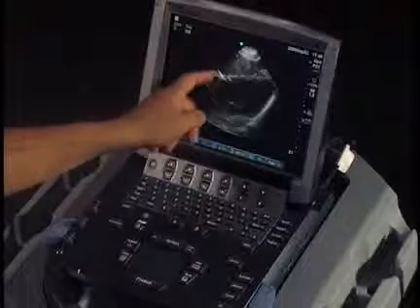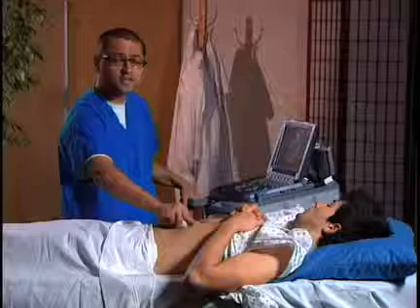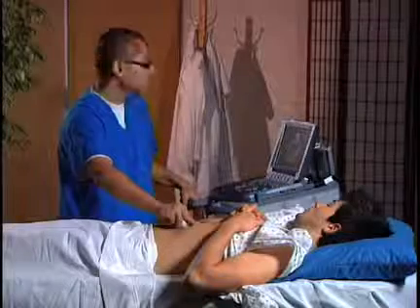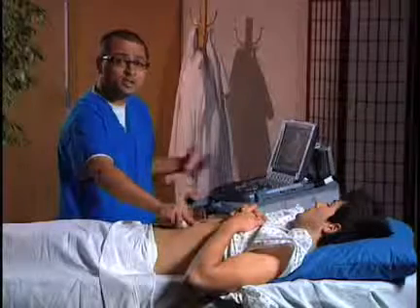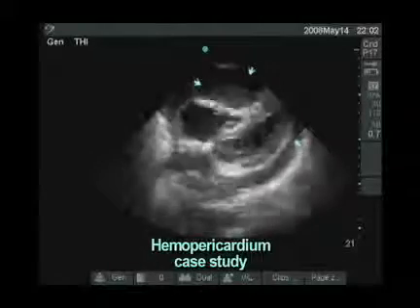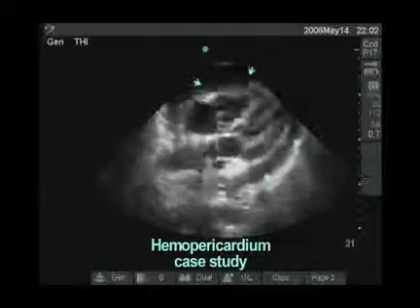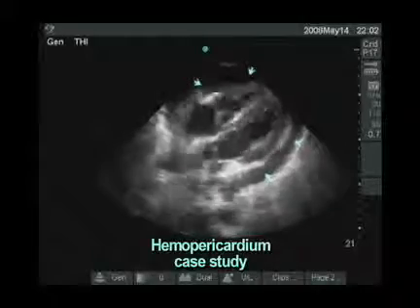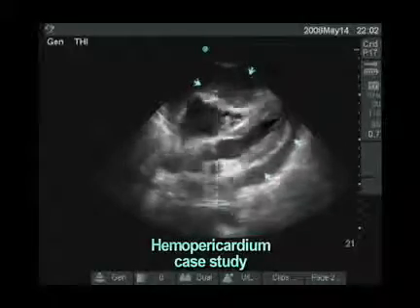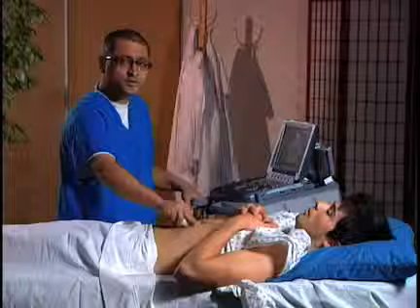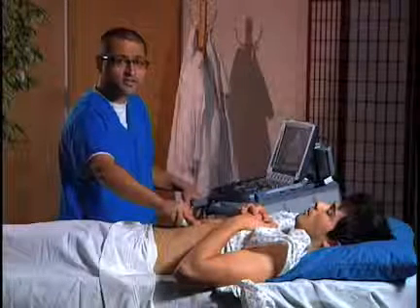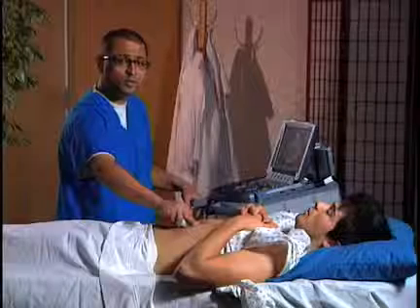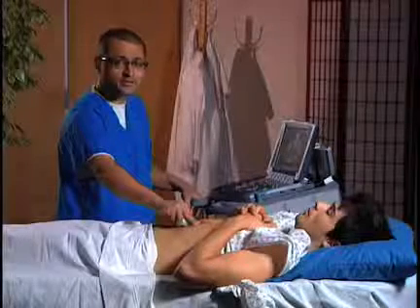Our focus on this exam is to identify the pericardium and look for free fluid within it. What we're looking for is an anechoic area within the pericardium, which would be signs of a hemopericardium. If you can't get this view, a great alternate is the parasternal view of the heart in a long axis plane, which we'll cover in the echocardiography section.